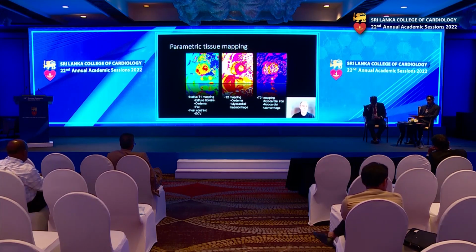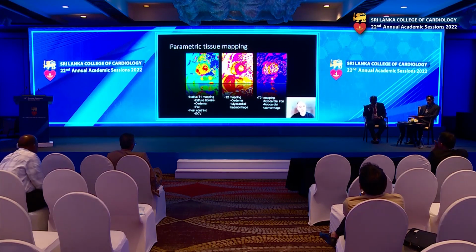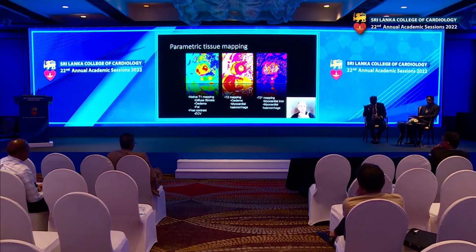Now, interestingly, there are a variety of different ways in which that relaxation happens, and we can exploit that because certain patterns of relaxation give us information about myocardial tissue. The terms that you'll hear me use are T1 weighted, T2 weighting, or T2 star. These numbers represent the type of myocardial proton spin relaxation. The important thing is that they are different physical parameters, and T1, T2, and T2 star mean different things.